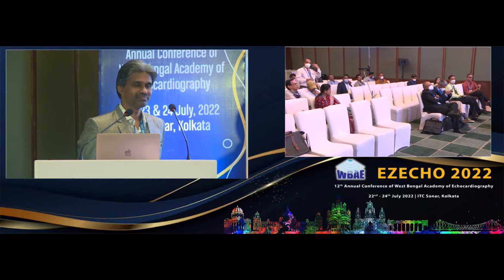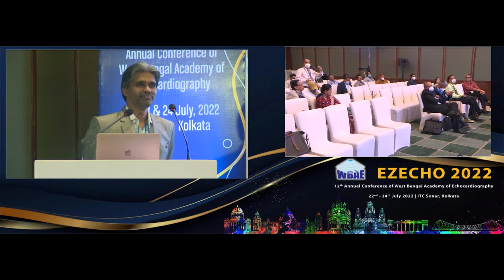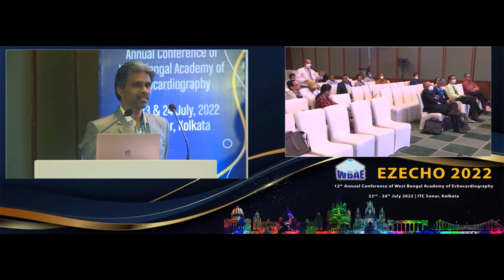If our index of suspicion of obstructive coronary artery disease is high, it is better to do a regular coronary angio. Sir, CT angio has a strong negative predictive value. So where we suspect that obstructive coronary artery disease is unlikely in a particular group of patients, CT angio is good enough. That is your gross opinion.